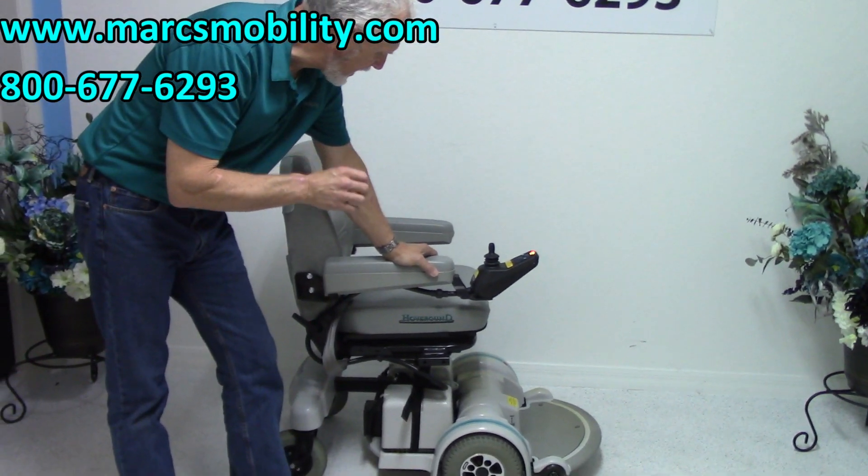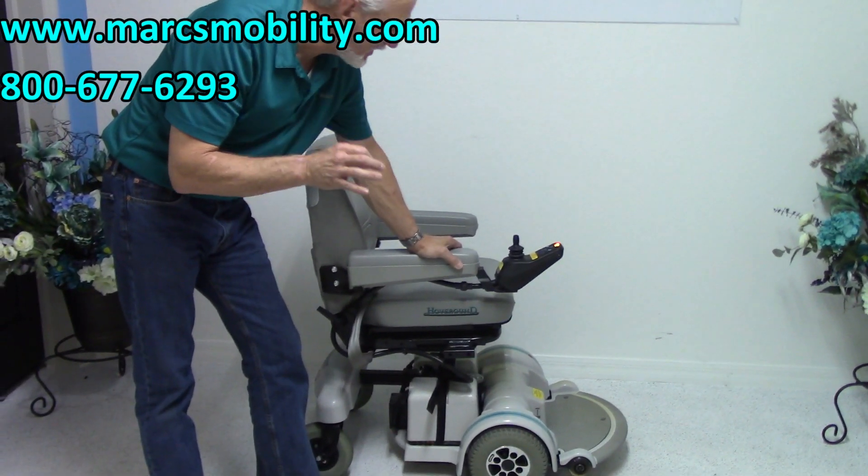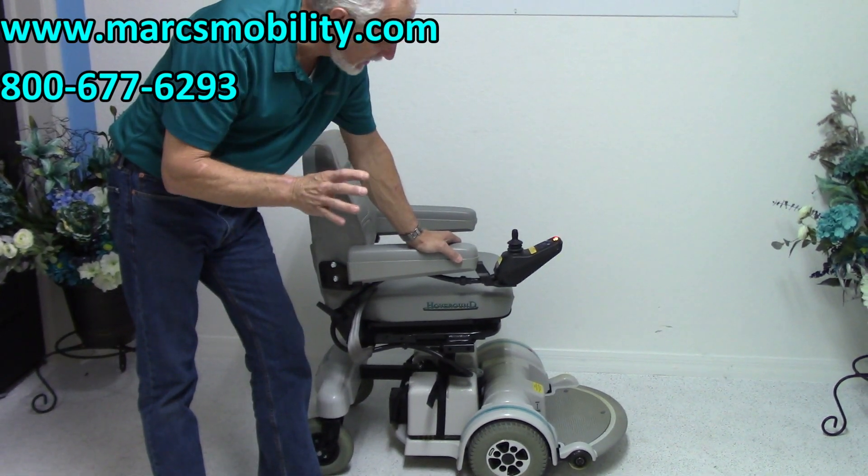This is a Hover-Round MPV5 power chair. This power chair is practically brand new.